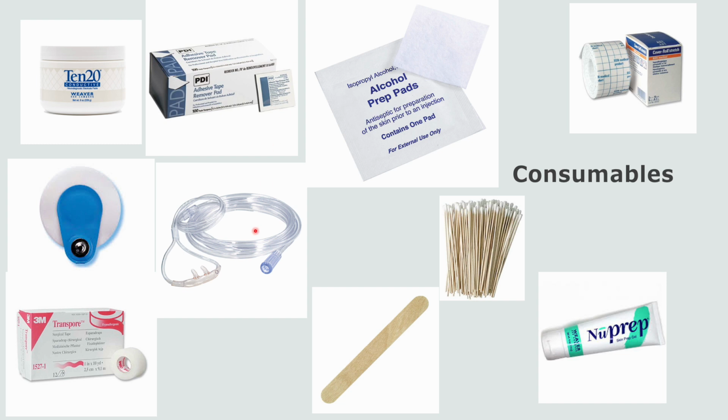Nasal cannulas are one-time use only, and the sticker snap-on electrodes are also disposable. You want to scrub the skin for all the electrodes that are gold cups or snap leads, the ones that you're getting an actual electrical signal from the patient. You don't need to scrub for the thermistor, the snore mic, or things like that.